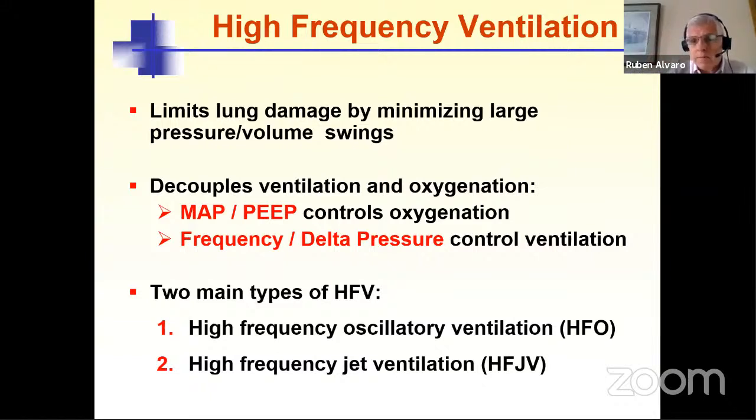And of course, I have my bias in favor of the jet. I have used both, the oscillator and the jet. And I truly think that, in my experience at least, when you get to know those ventilators well, the jet has an advantage. But of course, it also depends on what type of lung disease you're dealing with. But I think in general, the jet ventilator is a more physiologic ventilator than the oscillator.